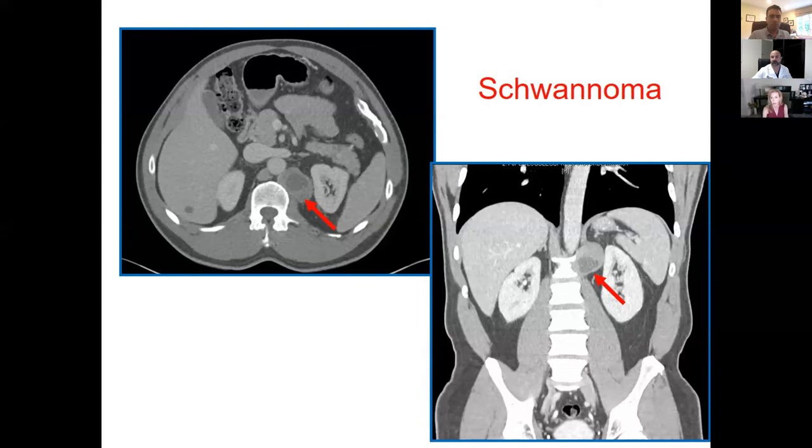The interesting thing is, I think our skull-based surgeon colleagues, our skull-based neurosurgeons, I try to think of lesions in terms of approaches. What approach is going to get me to this lesion? Jonathan, I'll ask this to you here. How would you localize this lesion? I gave you a coronal and an axial. Where would you say this lesion is if you were describing it to your colleague or partner?